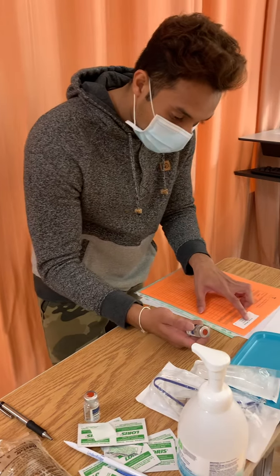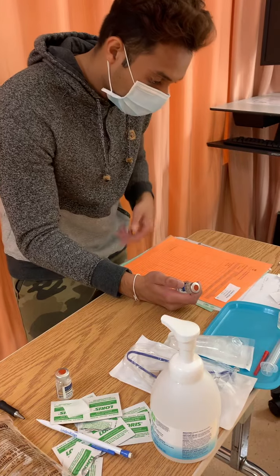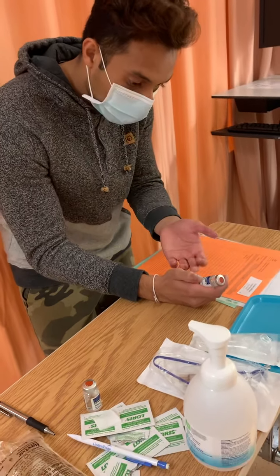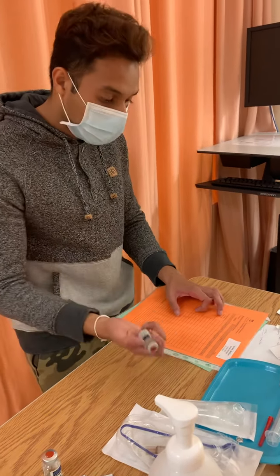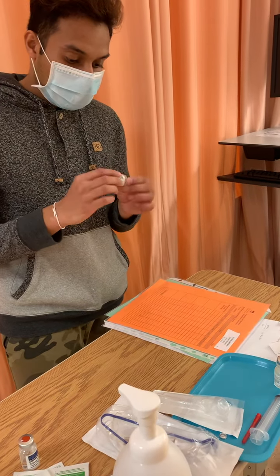So we have Watson William. He's allergic to shellfish, and we see that Azithromycin is the medication. It's a 500 milligram medication, and we need 500 milligrams out of a vial. It's an IV medication, given daily. It has not been given today, so we're going to give that medication today. It's not expired, and we see that it's intact as well, so it's all good.